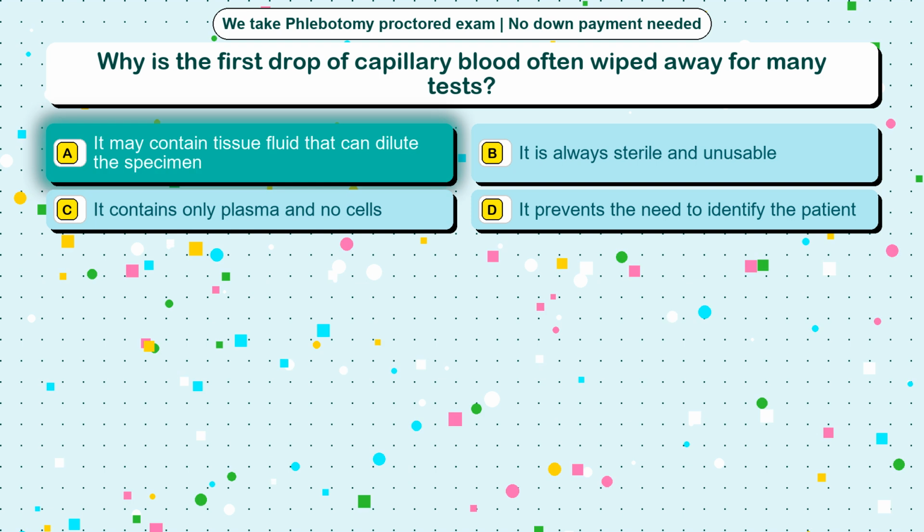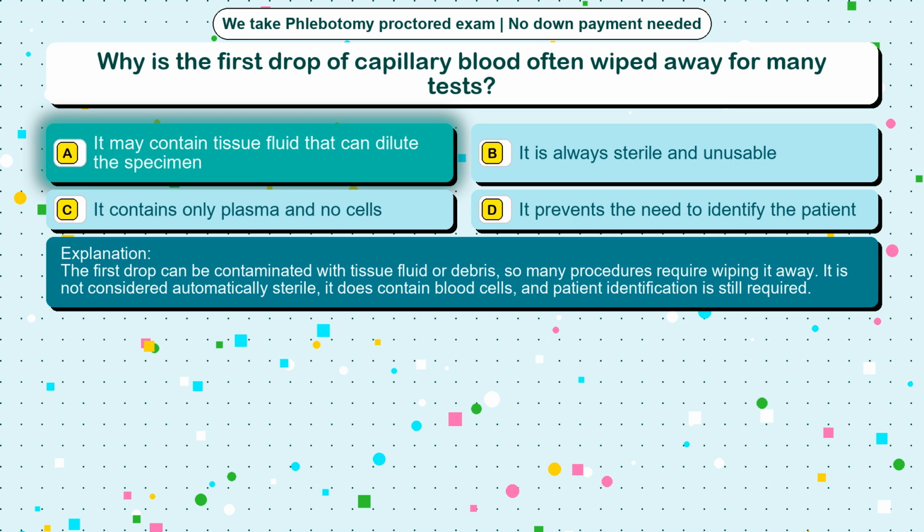It may contain tissue fluid that can dilute the specimen. The first drop can be contaminated with tissue fluid or debris, so many procedures require wiping it away.